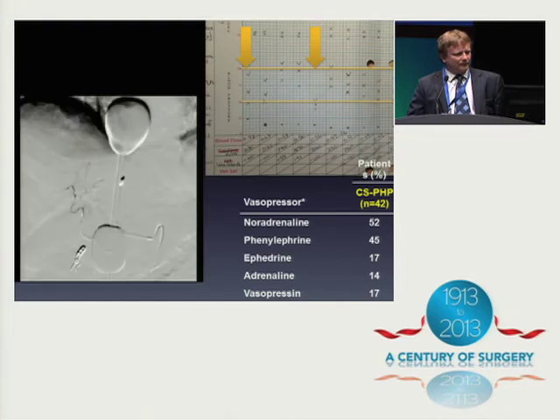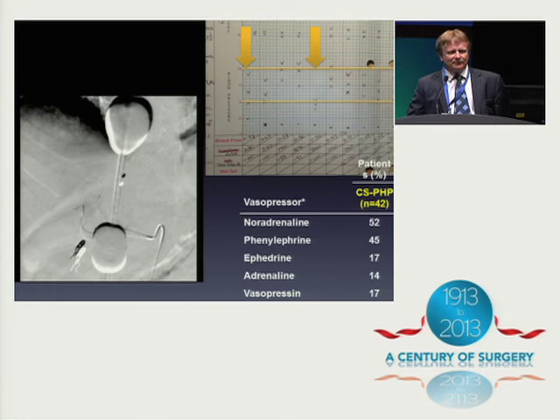And there are some major effects related to this. On the left, I've just seen an angiogram with some very weedy vessels, and that's because you get intense arterial vasospasm in the hepatic artery during the procedure. The hepatic artery doesn't like being pumped full of melphalan for some reason. And that's actually quite a problem, so you sometimes need to give GTN intra-arterially to enable the flow of the chemo agent.